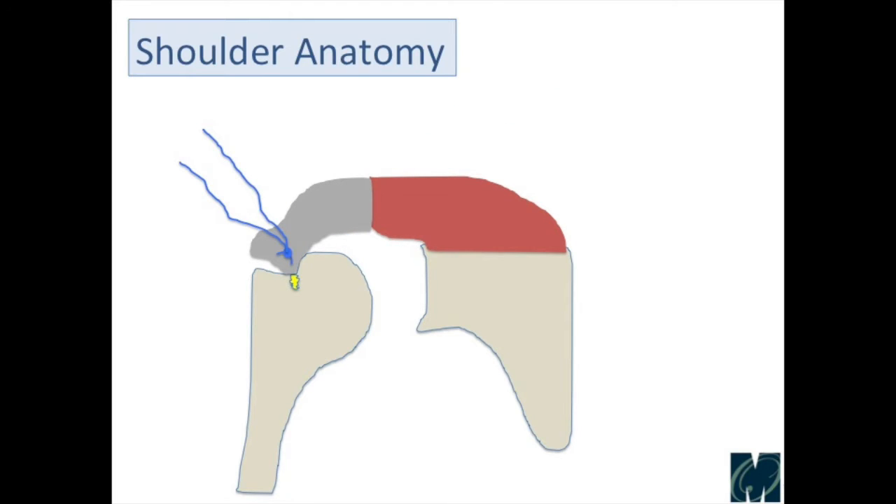In this diagram, you can see we've tied down that rotator cuff tendon from the first anchor. That first anchor is all the way near the ball — what we call medial. We're going to do a double row technique because that's biomechanically a stronger construct. We've now completed and tied down the medial row. As you can see, that lateral edge was still sticking up and we're going to have to repair that down.